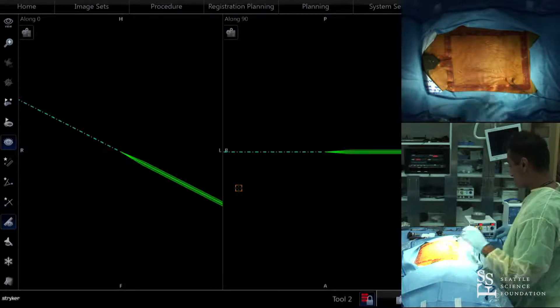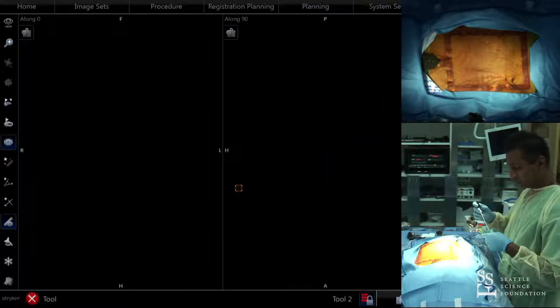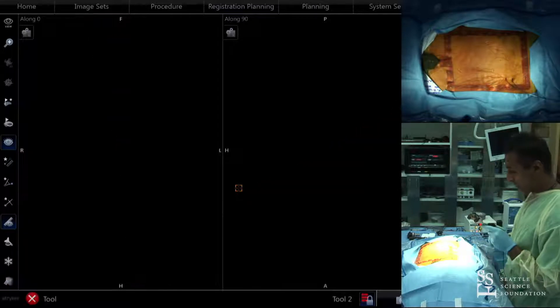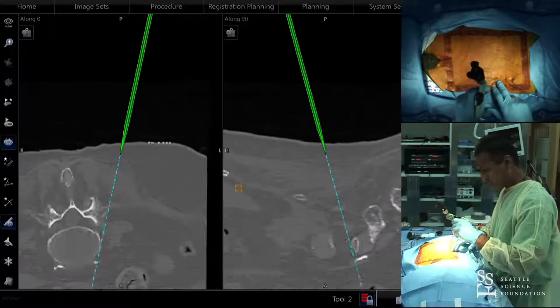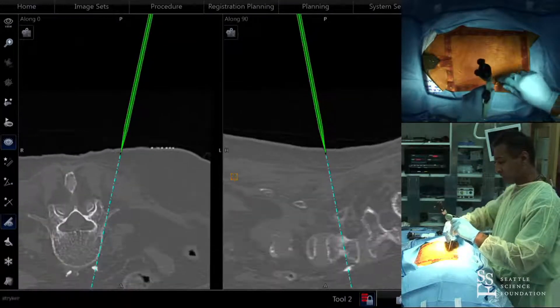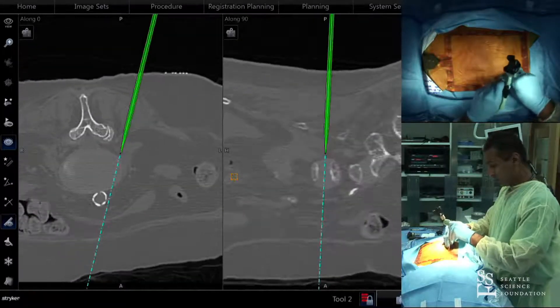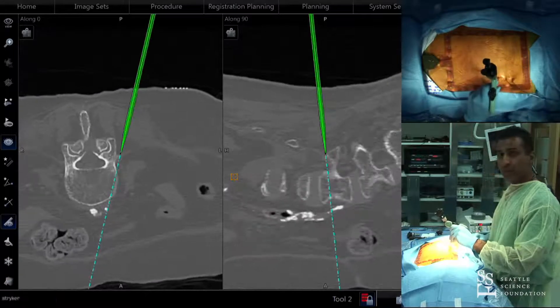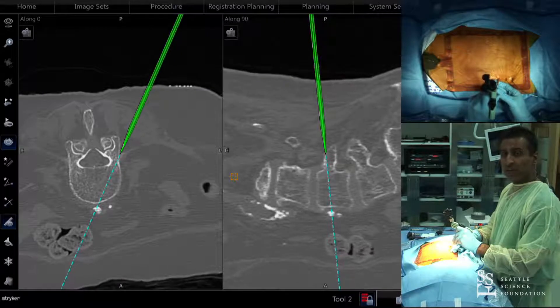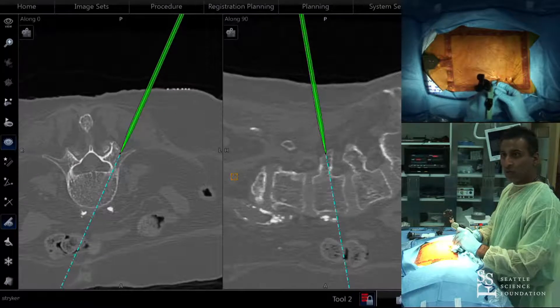For the starting point on the posterior elements, I aim toward the junction of the SAP and the transverse process. I tell fellows and residents to visualize this just like doing an open screw — feel the transverse process, put the Jamshidi down, feel it, and then walk it in to the junction of the transverse process and the facet joint. That gives a nice, ideal starting point.